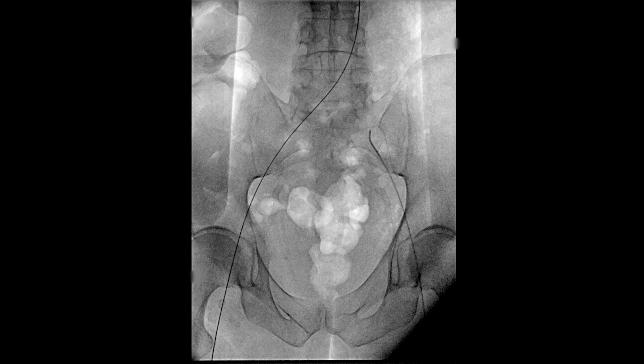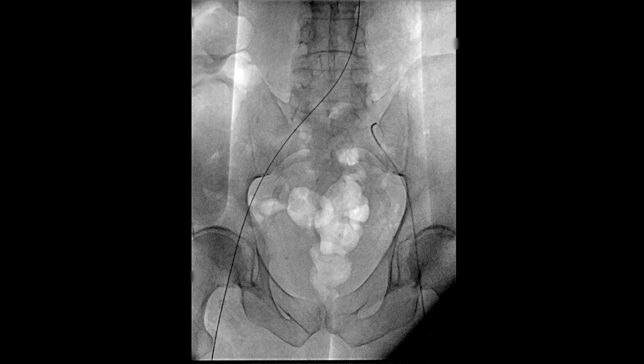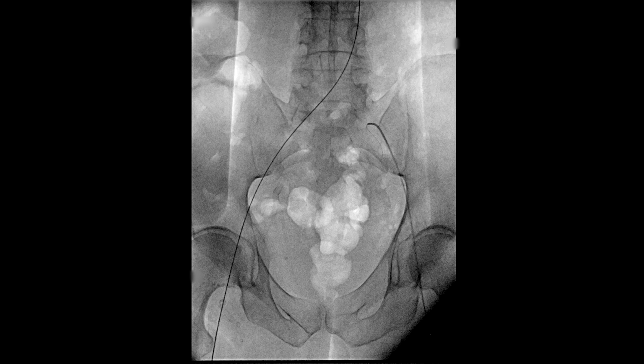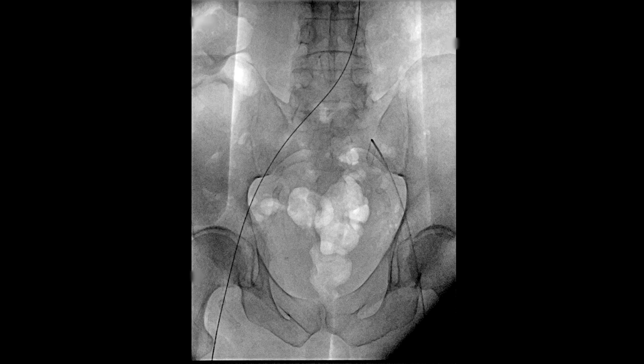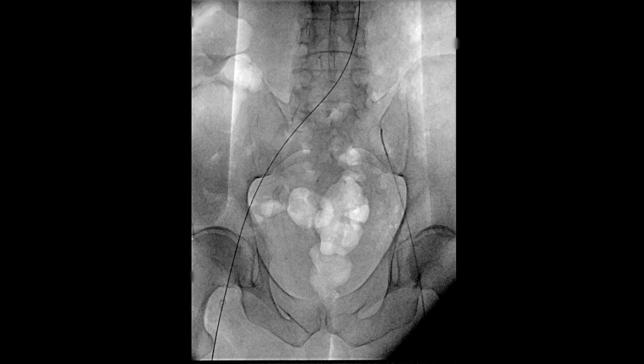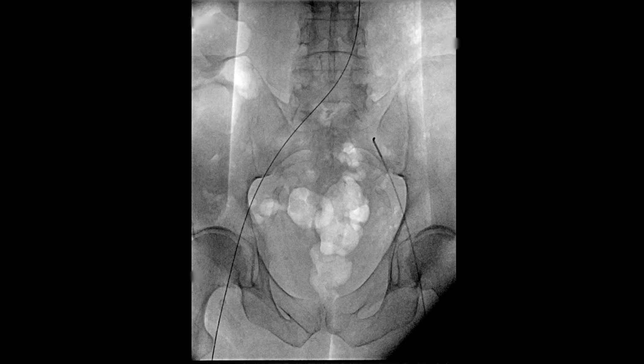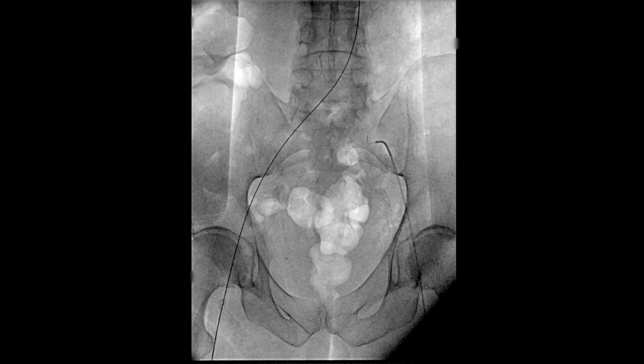This can be incredibly tedious depending on the chronicity of the thrombus. Here you can see multiple attempts to advance our wire and catheter combination without much success. It is very important when trying to cross these very chronic lesions to be rapidly seeking with the wire and catheter combination, looking for any little channel that might allow you to traverse the thrombus.